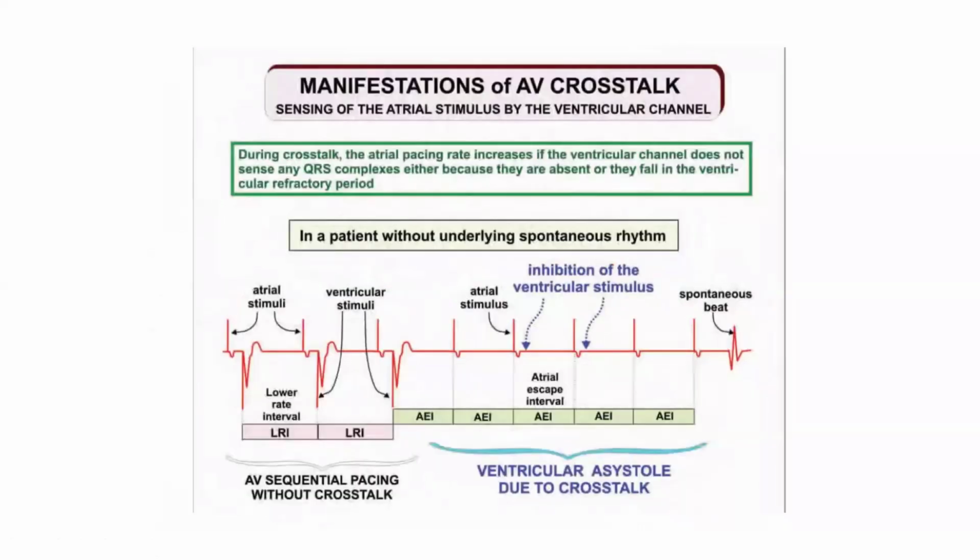Here, after we start using devices in this manner, we find that we may have a very important problem. What is this important problem? If I have atrial pacing with an atrial spike, and this atrial spike is big, the ventricular channel may see this atrial spike, meaning it feels this electricity. For the pacemaker, any electricity seen above a certain level is interpreted as a QRS complex.